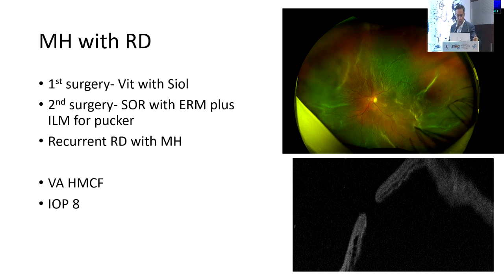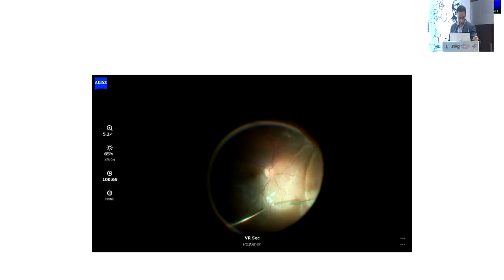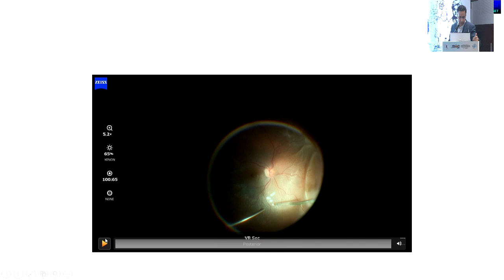This is a patient who had vitrectomy with oil, developed an ERM, and at that time had ERM plus ILM peeling for the pucker. The patient was referred to us with a recurrent RD. You can see the MH with RD. And this is the video.